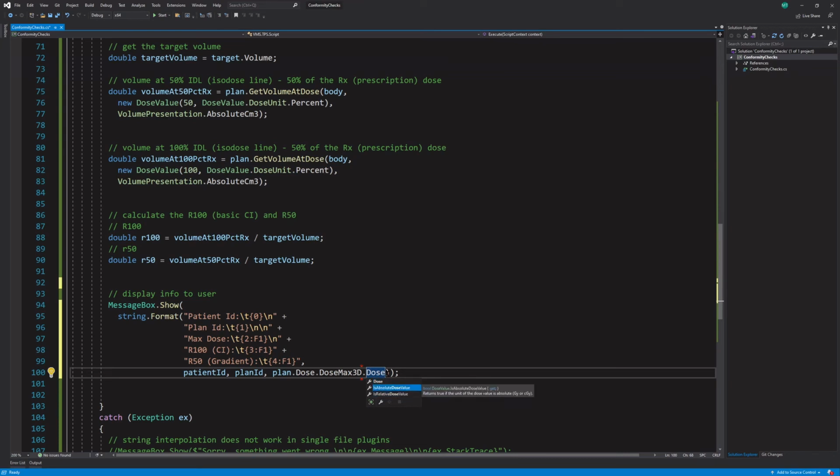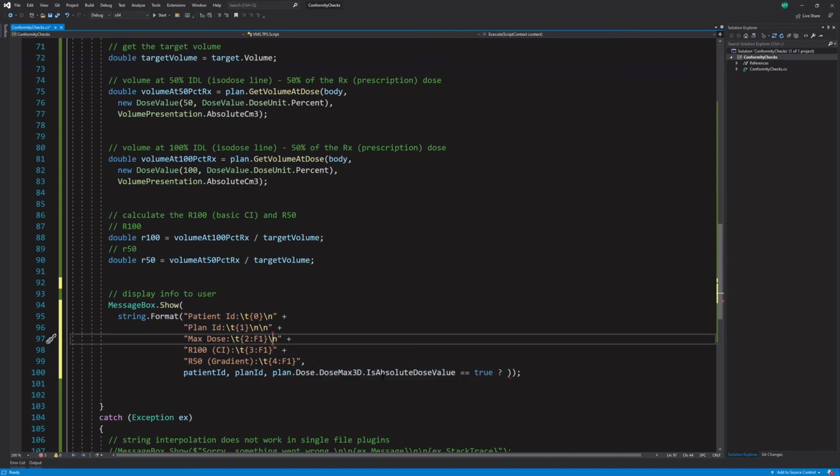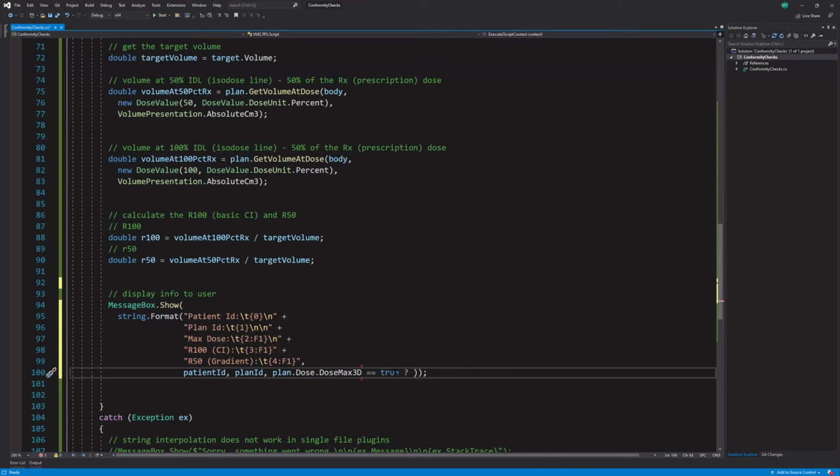So we could say is equals true. Then if it's absolute, I don't want to do this. I want to keep it simple. So for simplicity's sake, let's just not give it that value there. And what's nice is, let's get rid of this, because if you're new to programming, I don't want to mess with that now. We'll mess with that later.